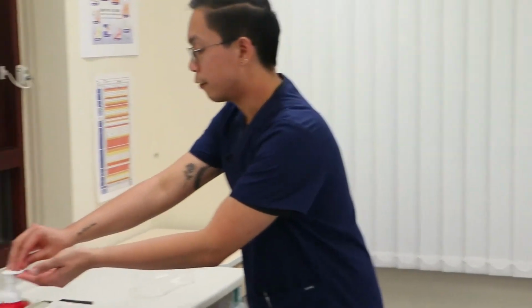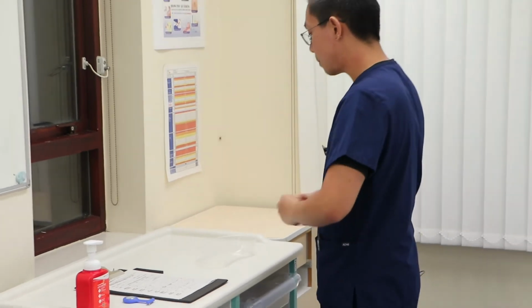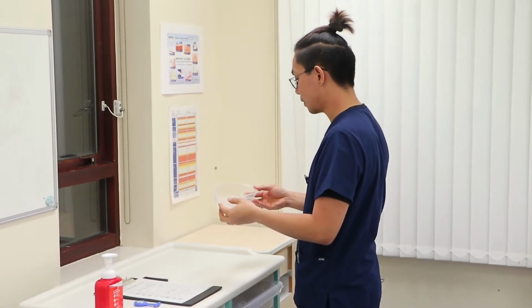I'm going to start off with my hand gel. I'm going to use a kidney basin or a tray, making sure it is clean, dry, intact, or has been disinfected for the last 24 hours. Assessor, is this safe for me to use? Clean and safe to use.